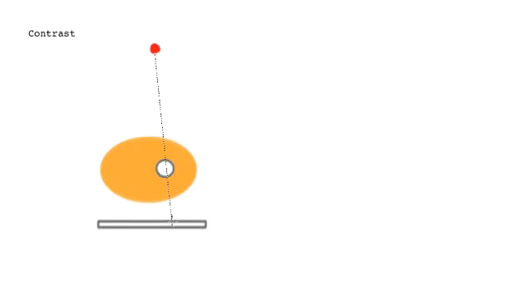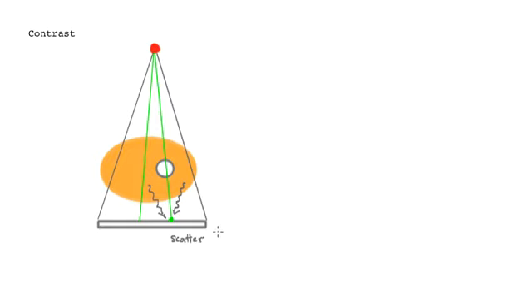So the goal of distinguishing contrast is to be able to tell the difference between the attenuation along these two ray lines, right? That's the goal of imaging contrast. So remember now that the field is quite large, though. And so because of that large field, you get scatter of photons from different parts of the field towards this pixel of interest. And so that scatter is an extra signal, an unwanted signal, that doesn't give you any information about what's inside the patient. It's just sort of a background fog. More photons, but they're not useful photons.